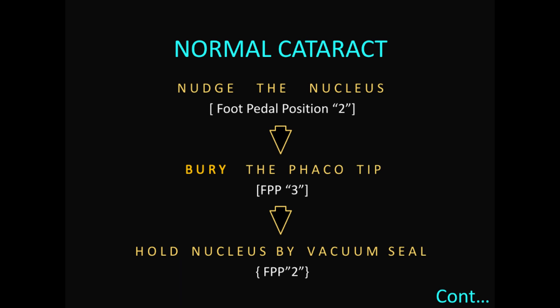Coming to the next concept: how in normal cataract surgery the nucleus is brought into the central safe zone for aspiration. Step one: nudge the nucleus with the foot pedal at position two. Step two: bury the phaco tip in the nucleus by giving phaco energy with foot pedal at position three. Step three: hold the nucleus with the vacuum seal by bringing the foot pedal back to position two — a vacuum seal is created and the nucleus is held and lollipoped onto the phaco tip.